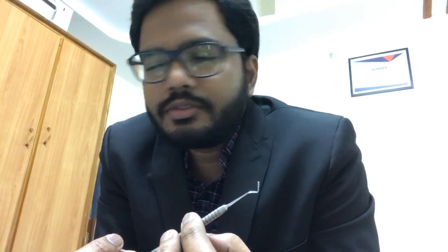Now identify this instrument. Yes, Nidhi, that's true. I mean, that's what I was telling. If we have a live through DSLR, then we can focus in specific. We'll have a varied focal length, focusing is possible. But here, since it's a front static cam, it's not really possible to focus in specific the instrument. I think it's clear now, comparatively. So this is a double-ended instrument, a cylindrical condenser. Yeah. So as you all know, it's used for condensing amalgam.